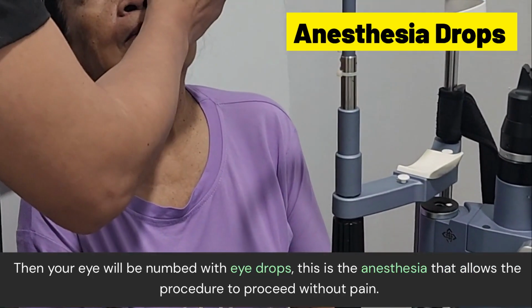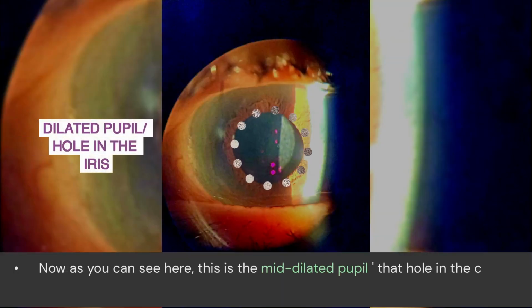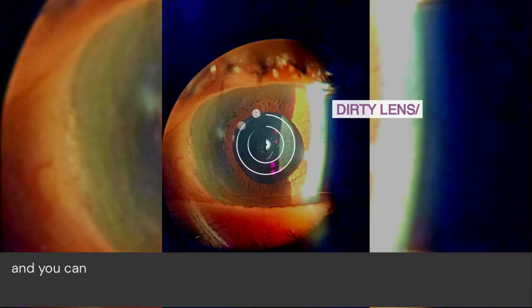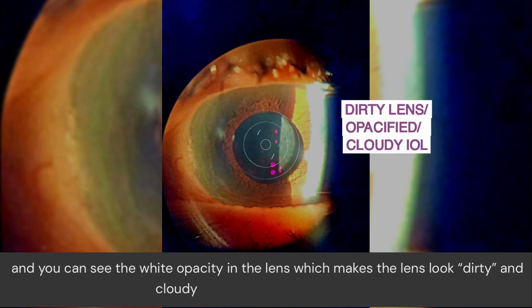Now, as you can see here, this is the mid-dilated pupil. The pupil is that hole in the colored part of your eye called the iris. Within that hole, you can see the white opacity in the lens, which makes the lens look dirty and cloudy and so obstructing the vision.